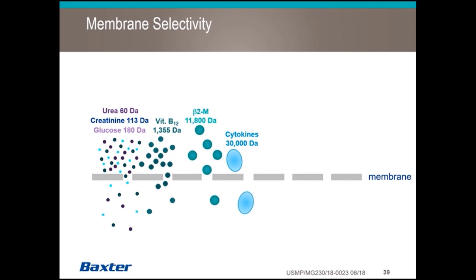In the ICU environment, obviously one of the most common diagnoses are patients that are septic or have inflammatory disorders, things like pneumonia, infected surgical wounds, influenza, for example. These patients are producing cytokines or inflammatory mediators that can be very heavy, that are not going to be able to be removed by diffusive therapy.